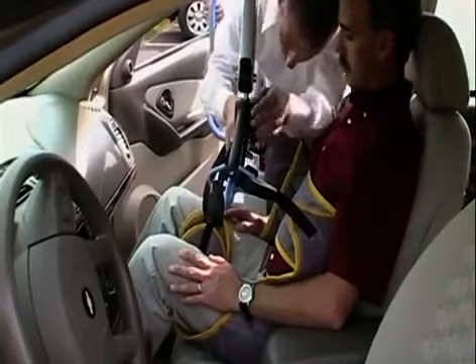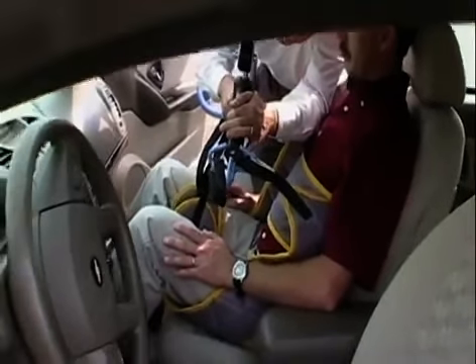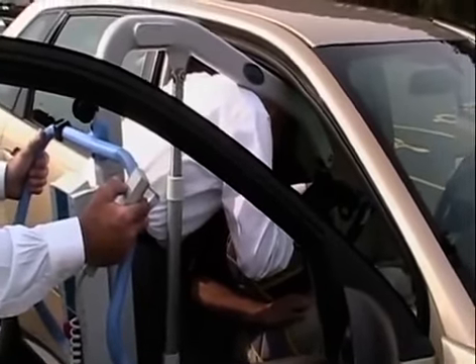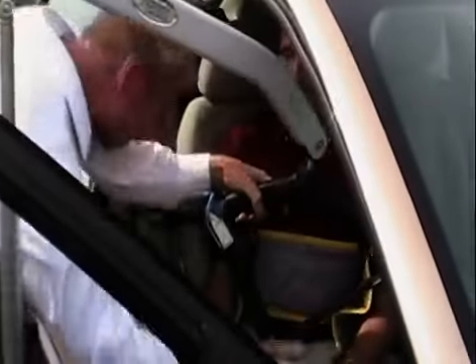After I've made that connection, we're going to go ahead and start to move the lifter out. So we've made our connections. Now, I'm going to have you turn your legs for me. Lift this leg up, pivot out. Lift that leg up, pivot out. If you can turn — that's perfect. Very good, just like that.